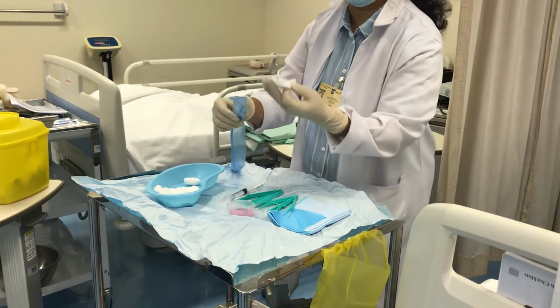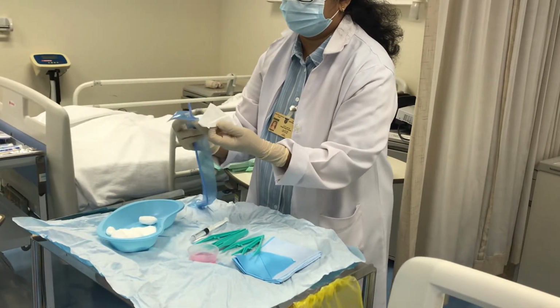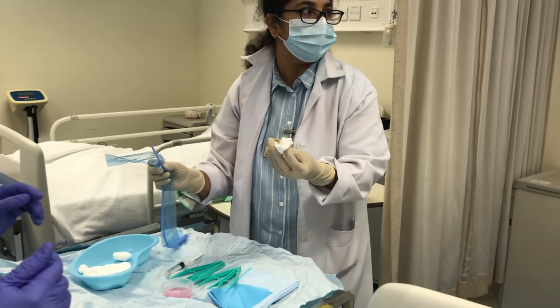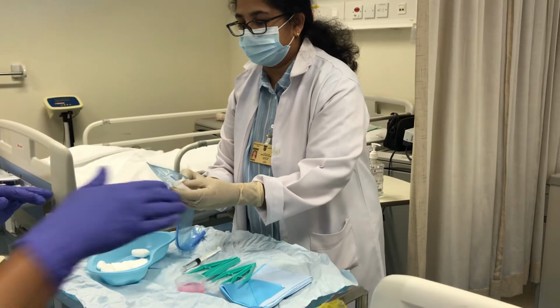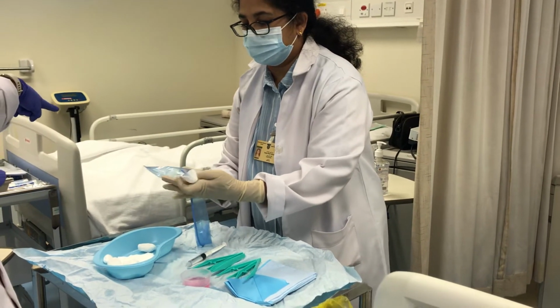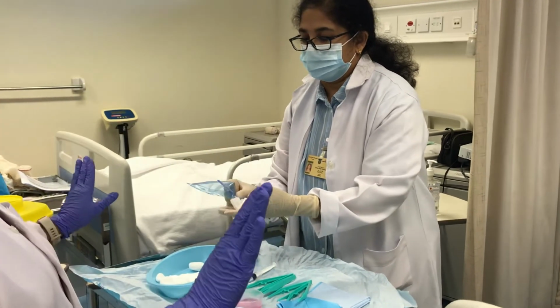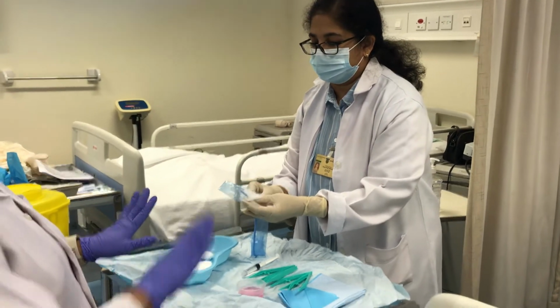So what I will do is I'll just open it. Can we go to the patient assessment now? We will come to that after this. First assessment is over. Position is actually important. You remember perineal care, we draped. Same way we need to drape the patient. Drape the patient, put the Inco sheet, keep the patient ready. Finish all your preparations, then you go to the patient.